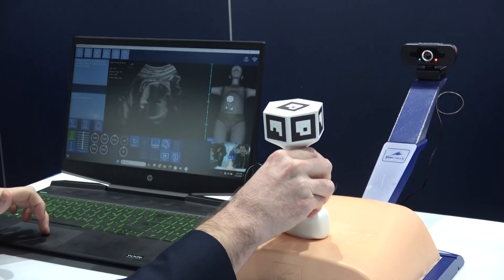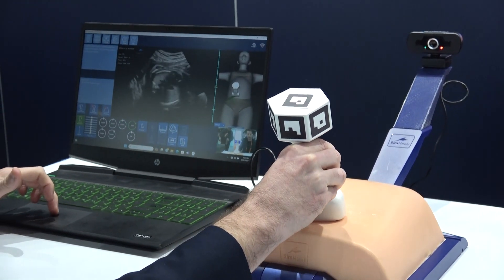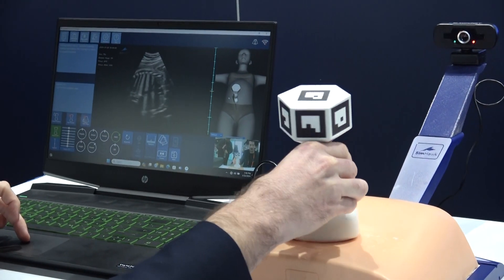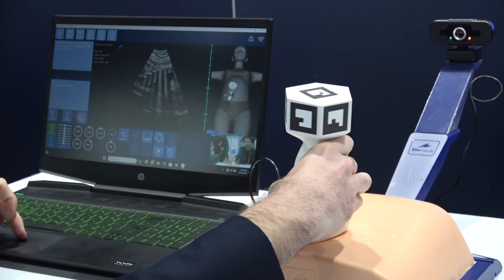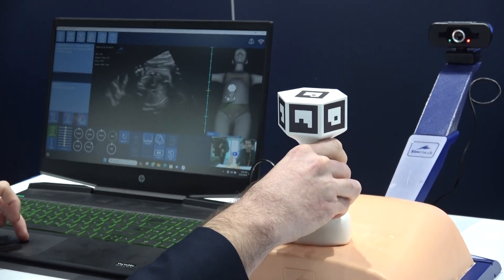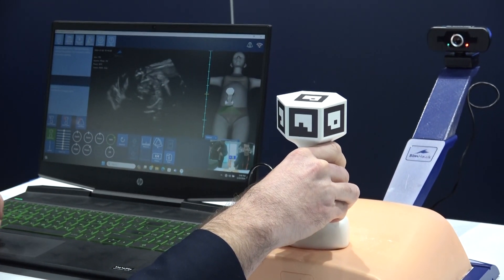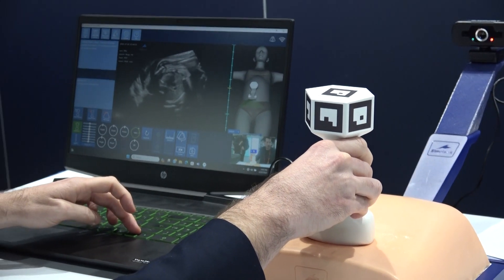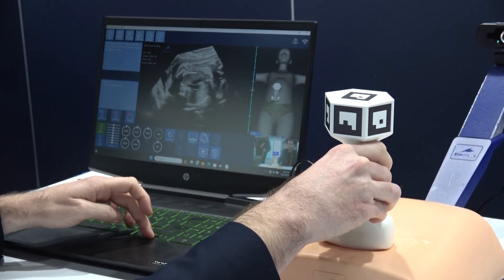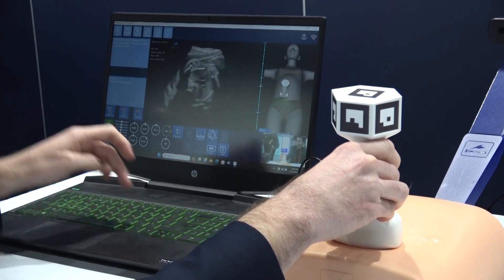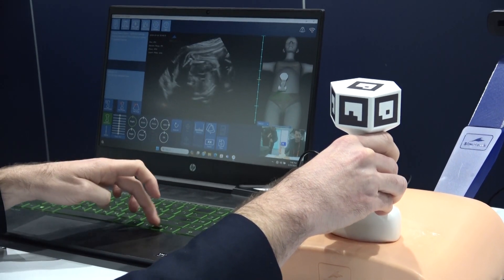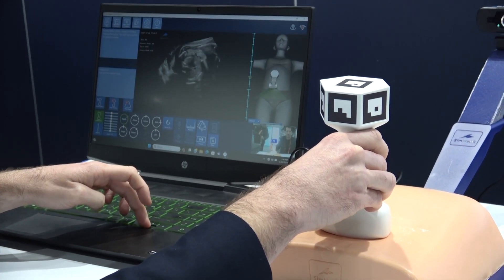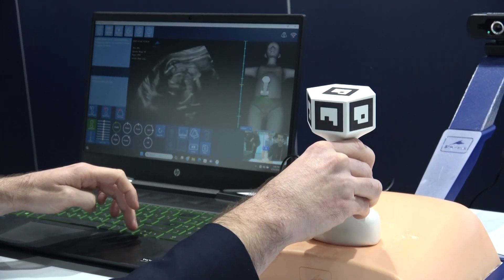I can go to the right, can go to the left, can go up and down. I can move it all around. And you can see I can play with the gain — let's say I want to do it darker or brighter. I can also play with the depth and you can go deeper or not.